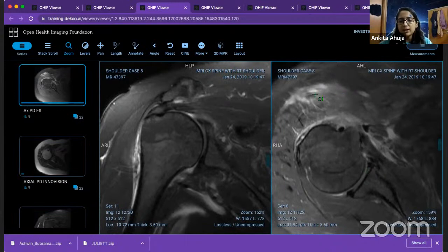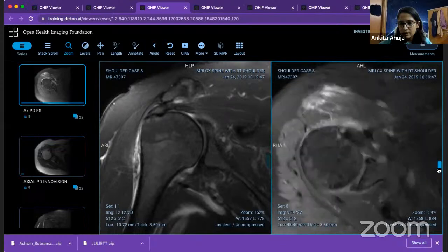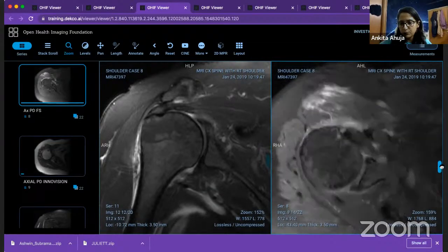If you see infection and muscle edema, you are mainly thinking if there is some abscess in the surrounding area. Here you see a lot of edema, but I don't see any collection or an abscess, right? This is joint effusion. So don't confuse, this is the subscapularis recess. Except that there is just this diffuse edema in the deltoid and in the subscapularis. And a lot of intermuscular plane fluid is there. Subacromial bursal fluid is there.